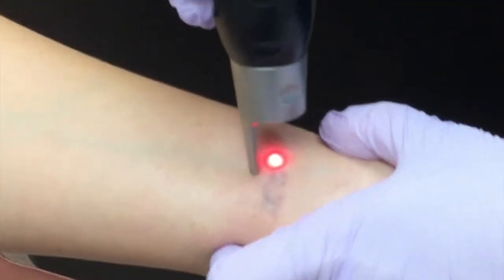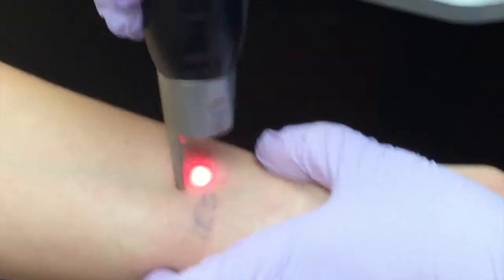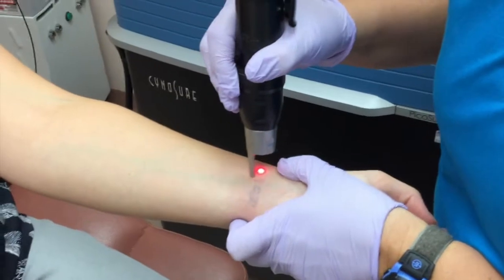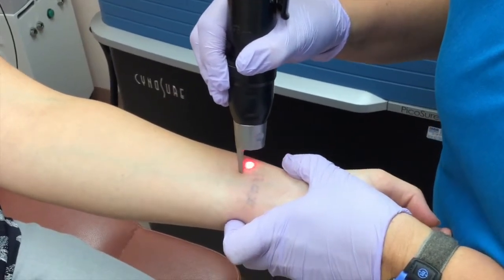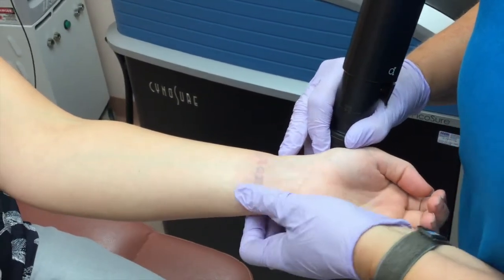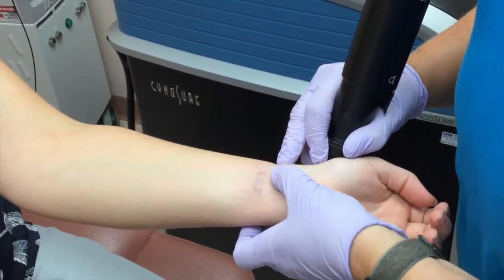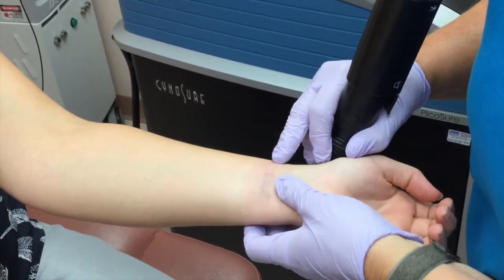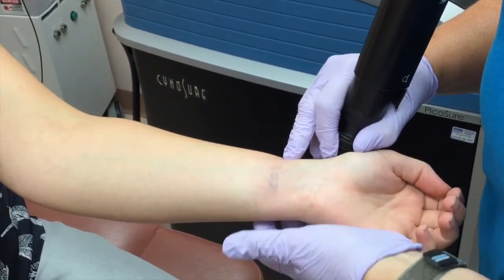So I think I got everything. It's very, very light when it comes to the reaction of your skin. It's not very pink, because there's not a large concentration of the ink. That's it. But you're just going to have a little bit of pink where I went over the image, and it will recover in a couple hours.